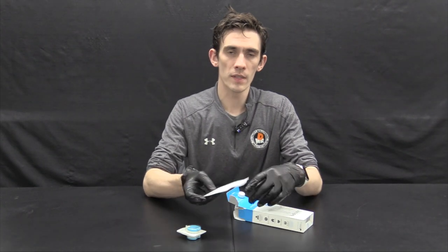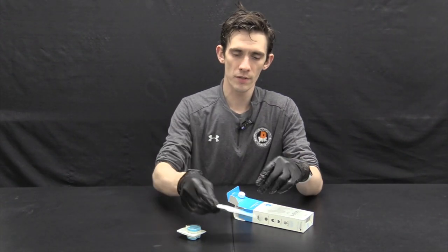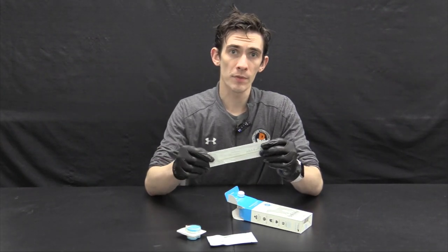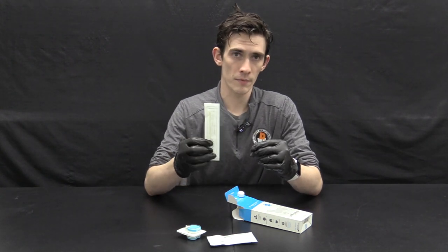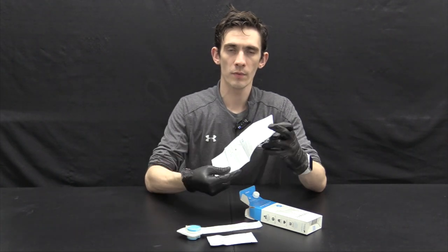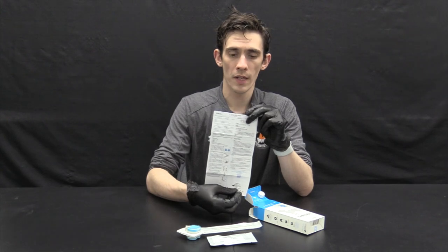We then have the actual test cartridge in its sealed foil package, the sample swab with which to swab the blood to mix with the buffer, and the instruction sheet. Be sure to take a look at this, as it will make anything unclear clear and get you ready to test.